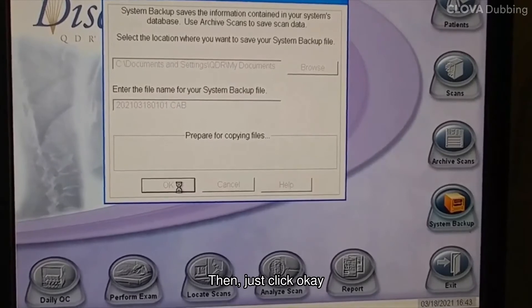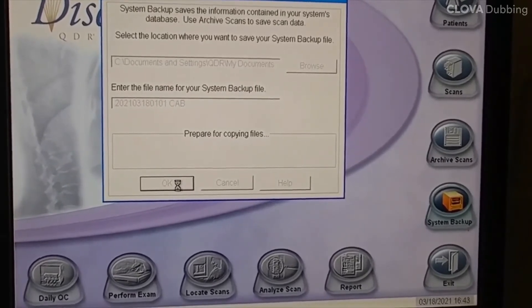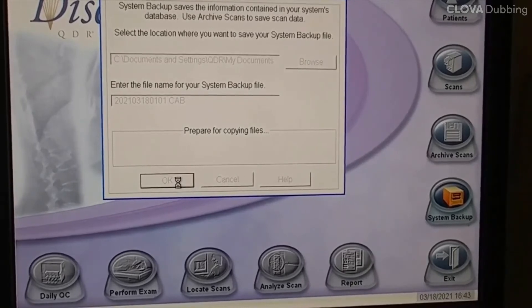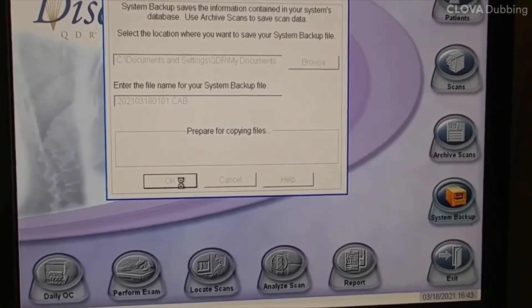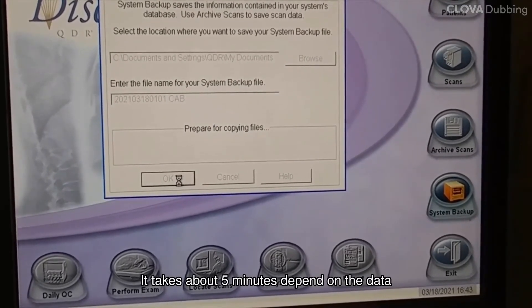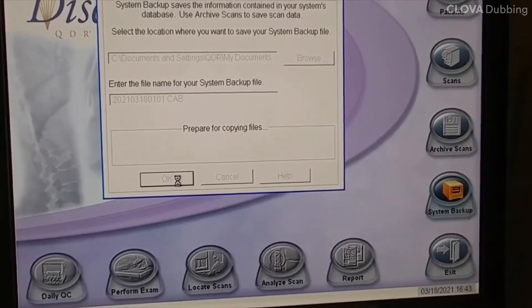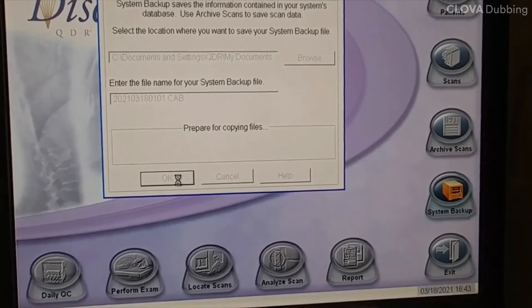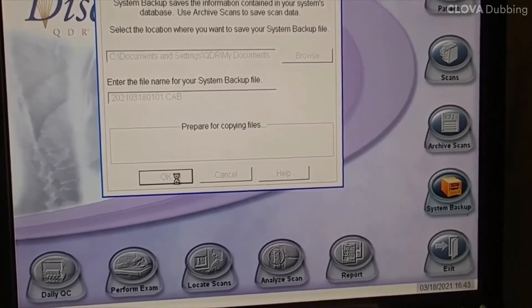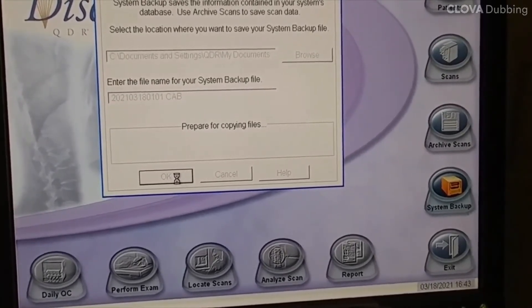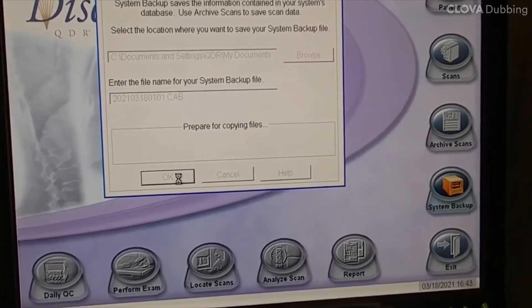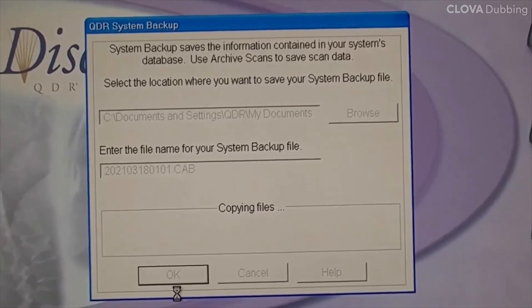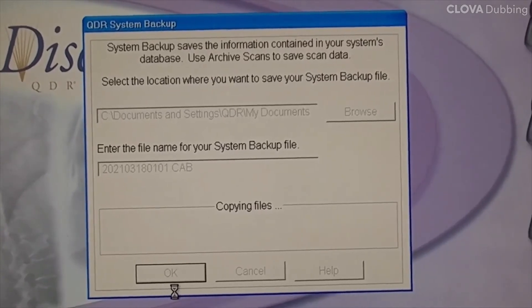Then just click OK. It takes about 5 minutes, depending on the data. Copying files done.